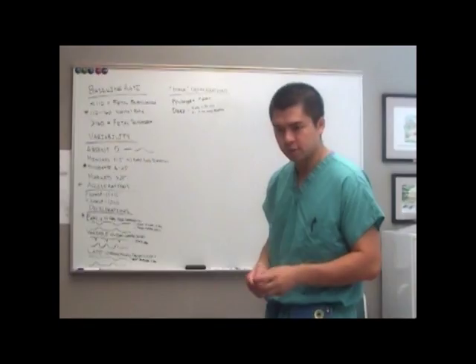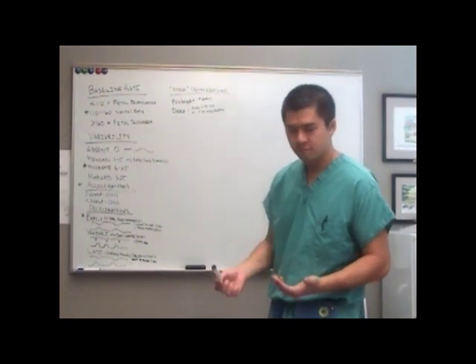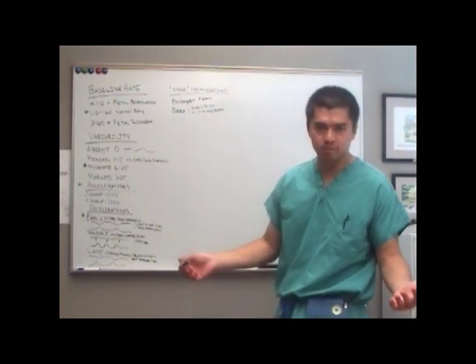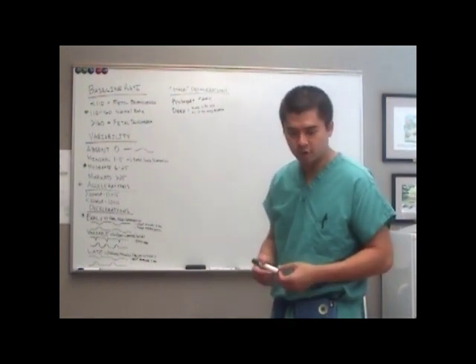Correct, fetal head compression, which is most commonly at a dilation of what? 4 to 7 centimeters. So if you see this, you might be expecting some change in your patient if they were not 4 to 7 before.